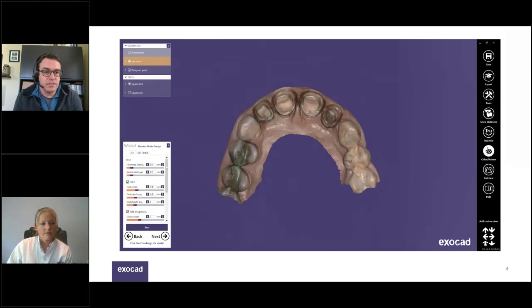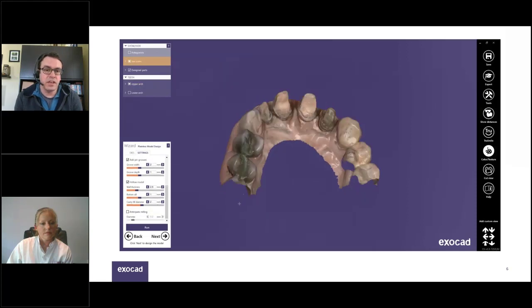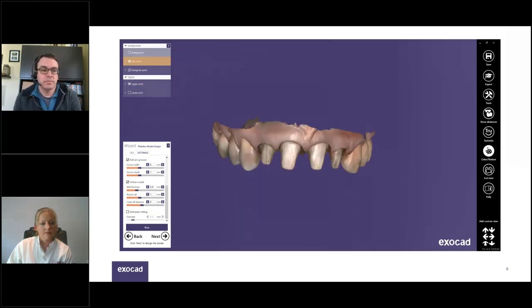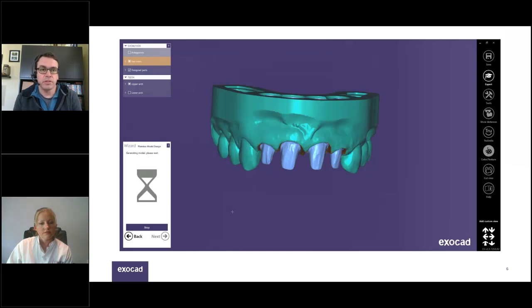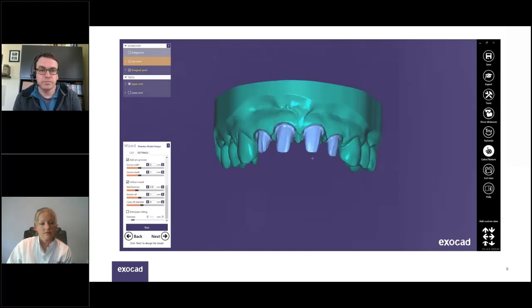And then we're going to jump over to the other settings tab, and this will adjust things like thickness of the walls of the model. We can tell it if it's a solid or a hollow model. We're going to run the calculation here. We can see the dies being generated, and we're going to calculate a hollow model, which is better for 3D printing. We'll use less material.